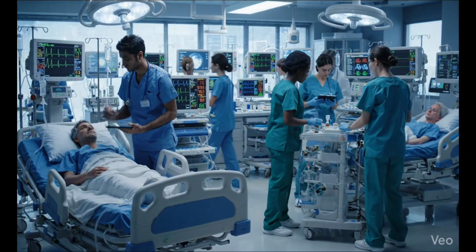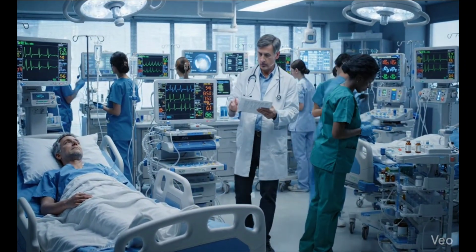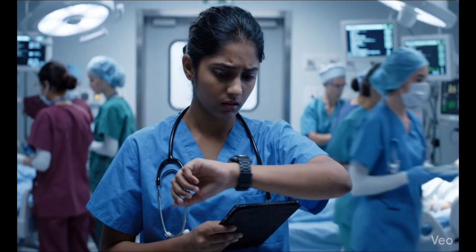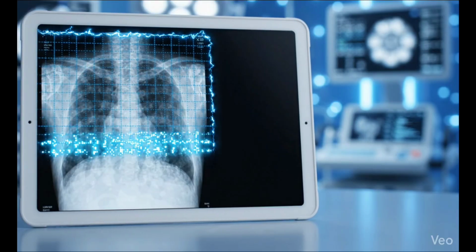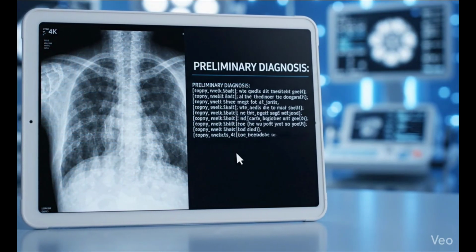In most hospitals, the chief cardiology surgeon spends the day in the operating room. So in the ICU, junior doctors and nurses are stuck waiting for the senior, even on simple procedures. Patients wait. Care is delayed. So we built an agent that reads the patient's imaging and labs and drafts a preliminary diagnosis before the junior needs to call the senior.